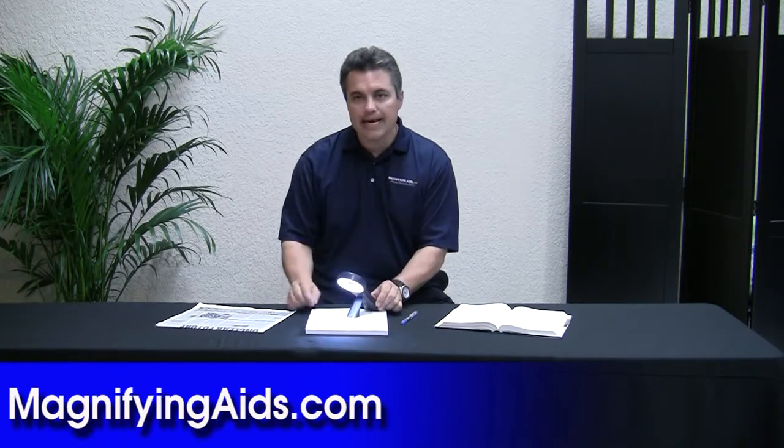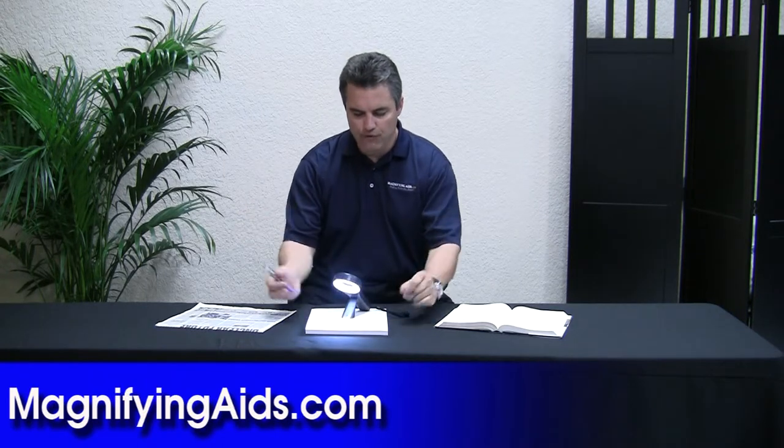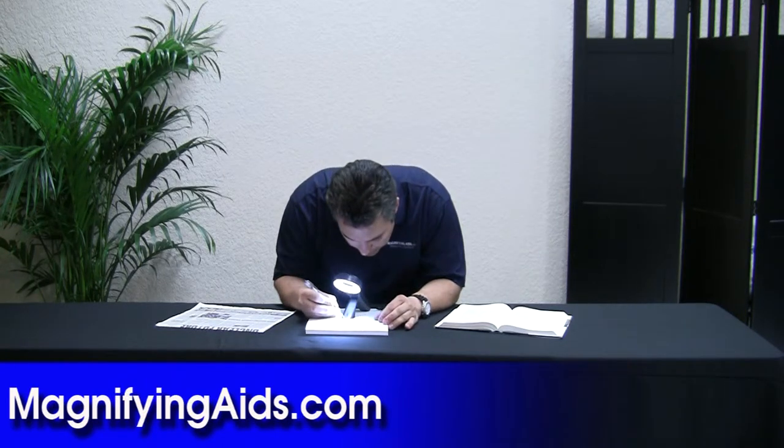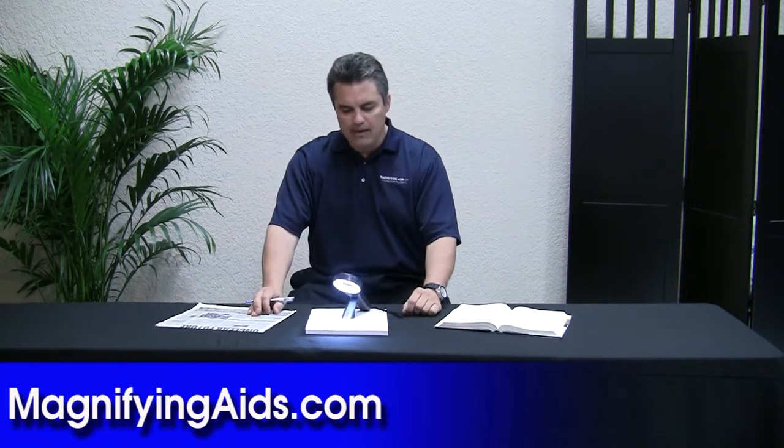The unique thing about this is it has a stand, so if I want I can pull the stand out — or it collapses — but I'm going to pull it out, and both my hands are free. I have to get a little closer, and then I can actually write underneath it. This is going to give me my 2.5x magnification.